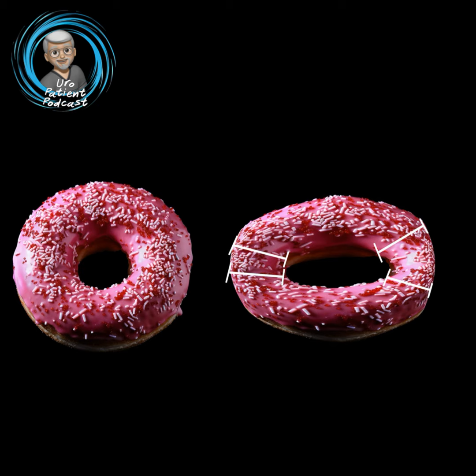And recovery, as I said, is kind of like 2 to 4 weeks. I kind of put it at 2 to 3 weeks. Again, you may be uncomfortable with urinations from irritation of having that scope placed, but it goes away pretty quick. And you don't have to have a catheter, so you don't have that to recover from. And how well does it work? Well, there's good documentation of 5-year data on this one also, with good efficacy. So it does work well. In the appropriate patient, this can be a good treatment option for you.